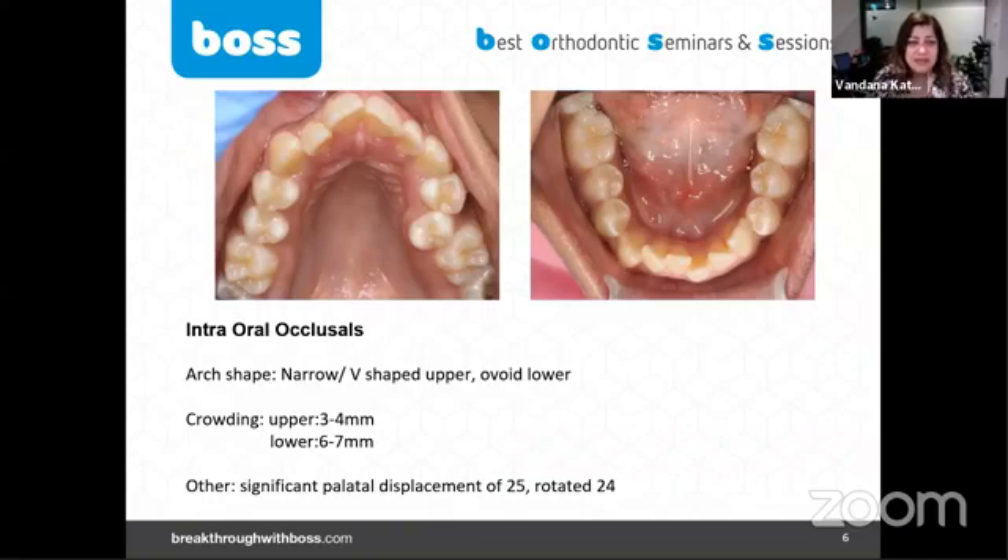We've got nice occlusal shots but there's a V-shaped arch, which is very obvious, with mild dental crossbites on teeth 12 and 25. I think the crowding estimate I corrected here is a little bit more than we think — it's more moderate, not mild crowding in the upper arch.